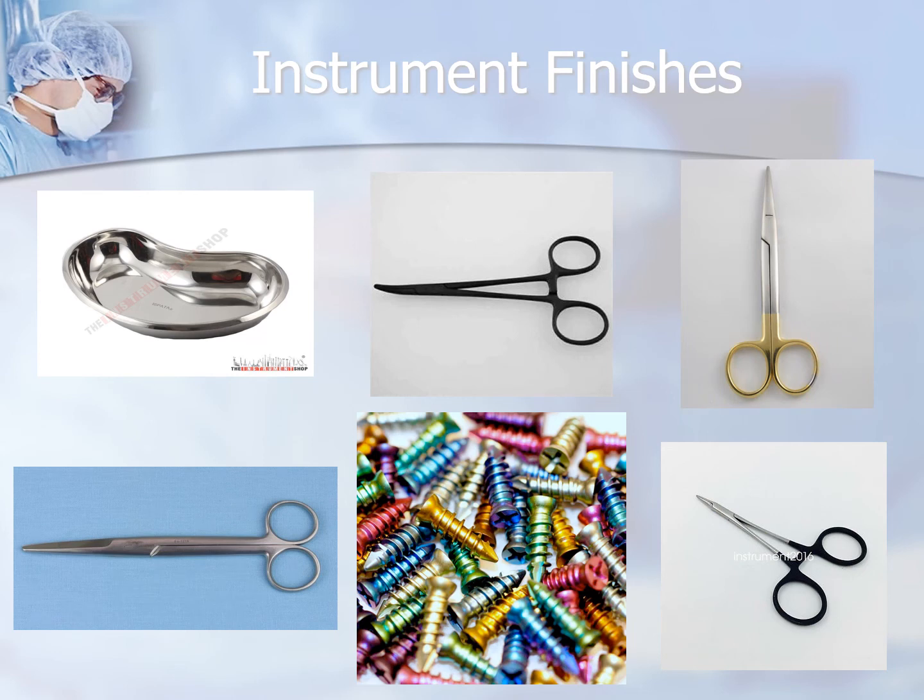So we have the black handle ones and the gold handle ones, signifying that tungsten carbide insert or cutting edge.